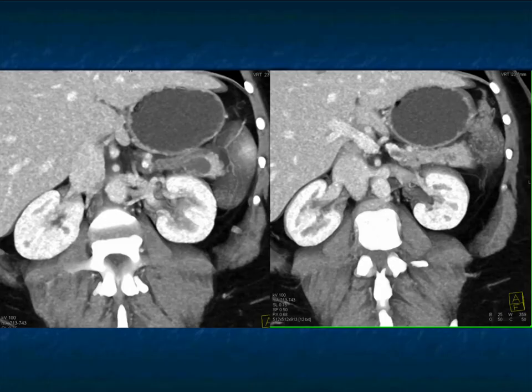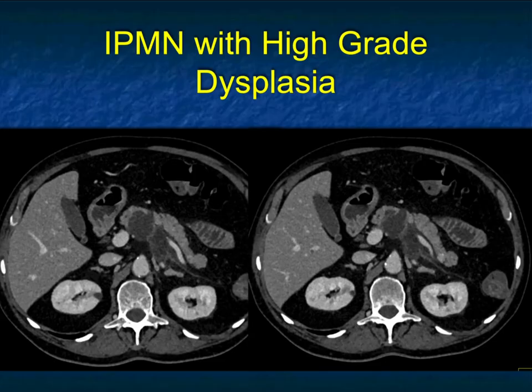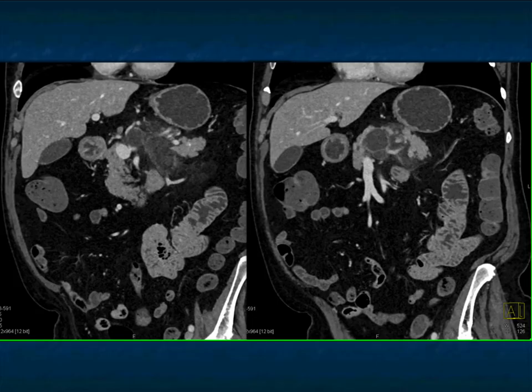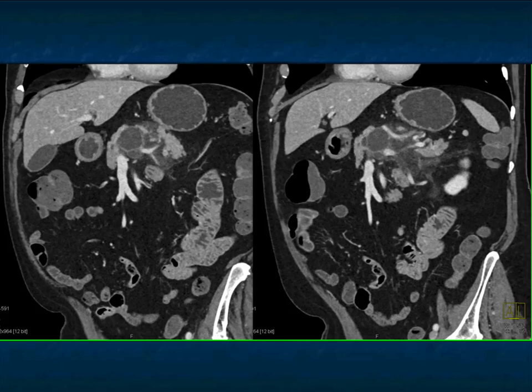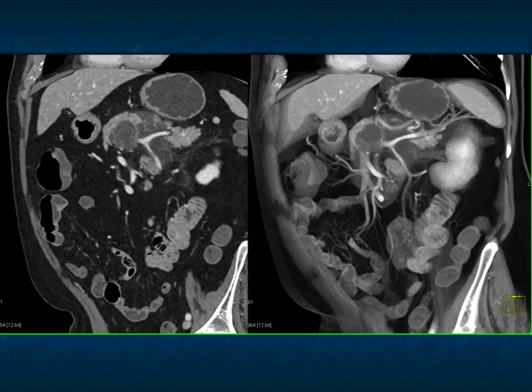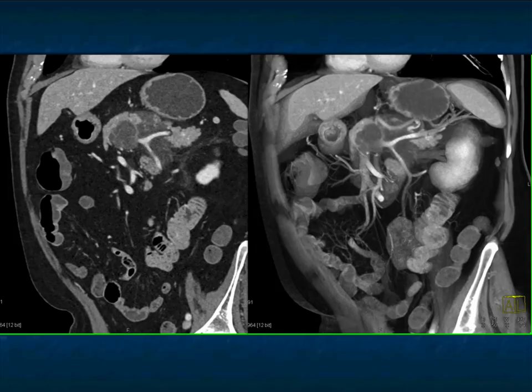The concern increases as you go from axial to coronal to volume rendering — but it was high-grade dysplasia. Another case of high-grade dysplasia: septations, size, nodularity. It's cystic — yes, it's an IPMN. You could consider a serous cystadenoma, but it doesn't have that look. This lesion would at minimum be sampled, but you'd really have to worry. The septations, thickening, nodularity — multiple components all together make you very concerned.